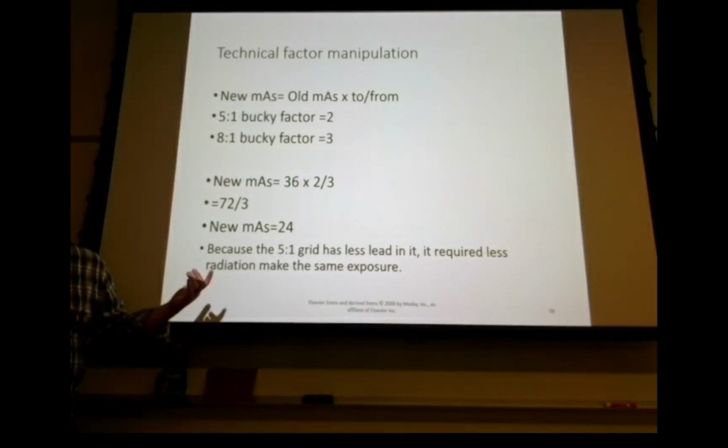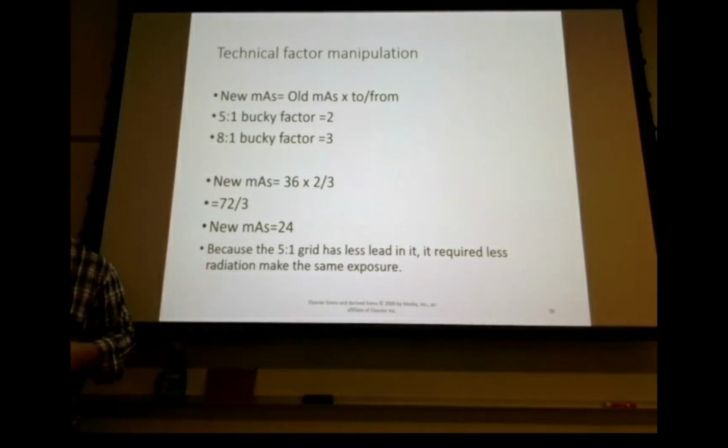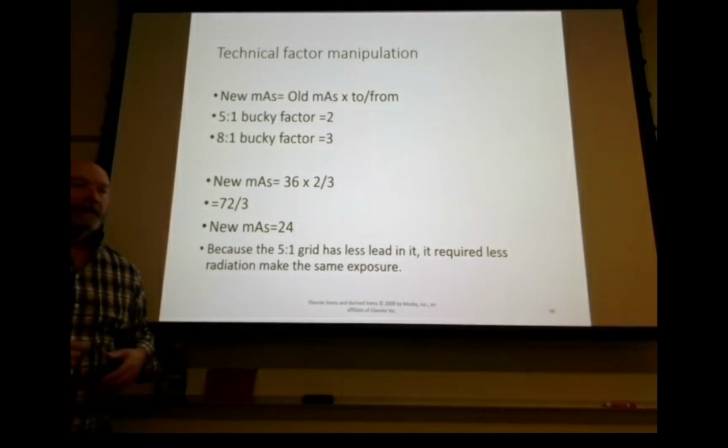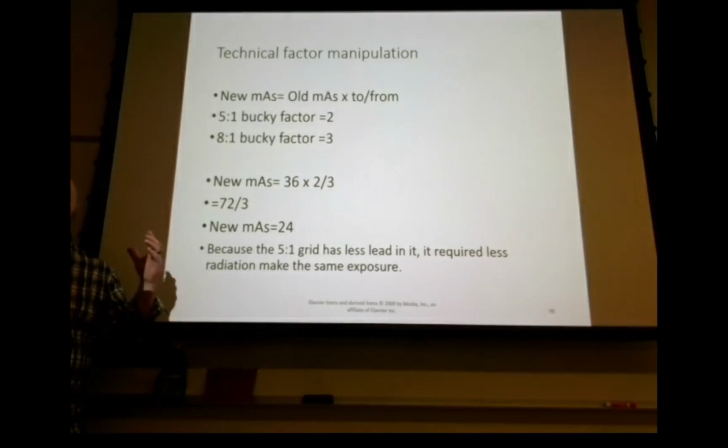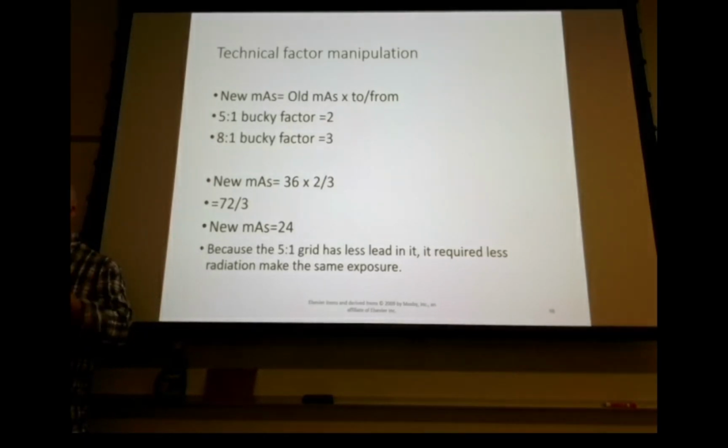So if you set a technique of, I don't know, let's say you shoot a chest x-ray, 110 kVp, then it knows that off that 110 kVp x-ray beam, you should have a lot of high energy photons coming through the patient, right? So not many 10 kVp photons should be striking the image receptor. So if it measures that level, then it disregards it.